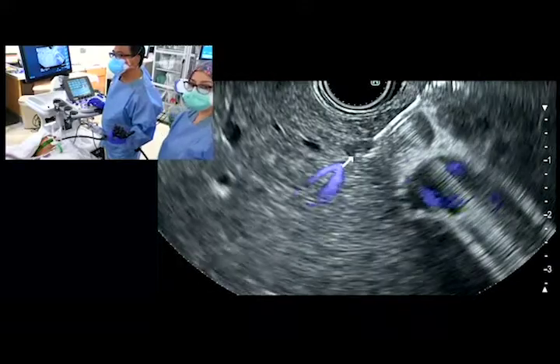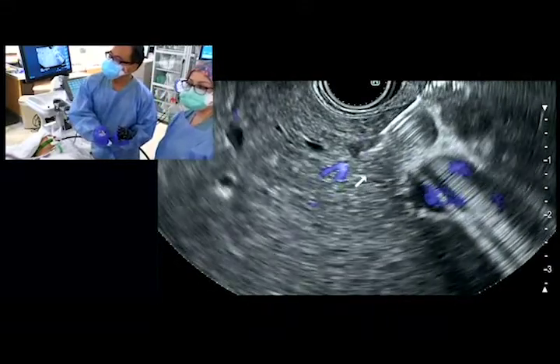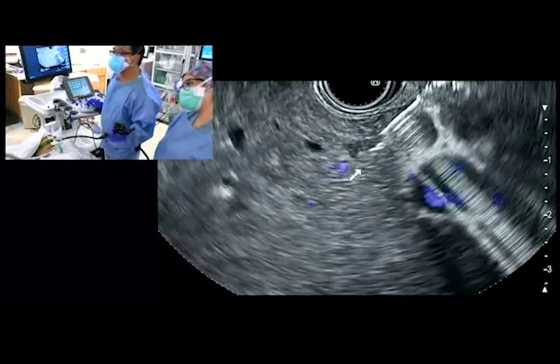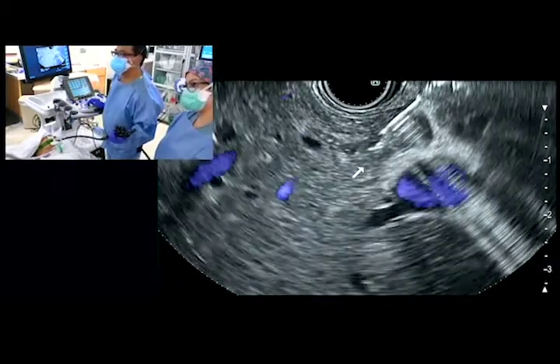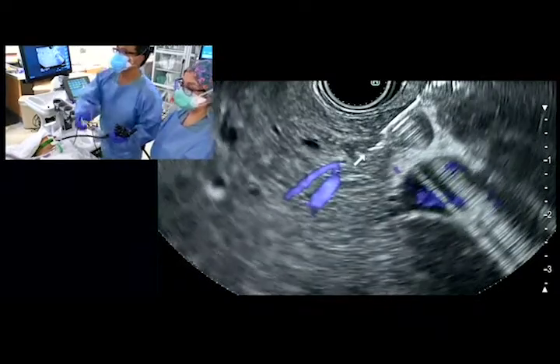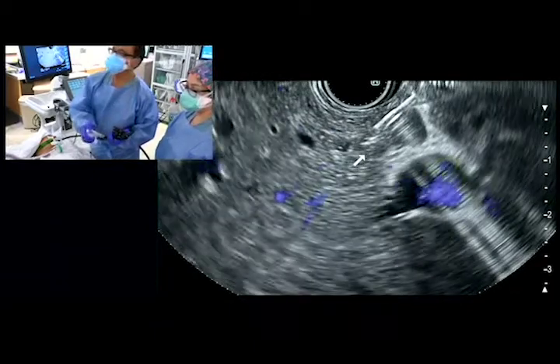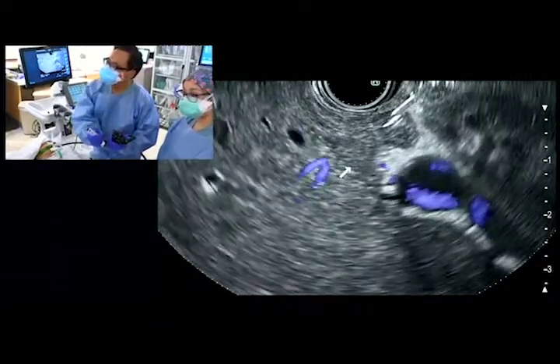We can still see active flow within our biopsy tract; however, the blood patch is preventing flow towards the needle as it is removed from the liver. It is now safe to remove the needle from the liver.